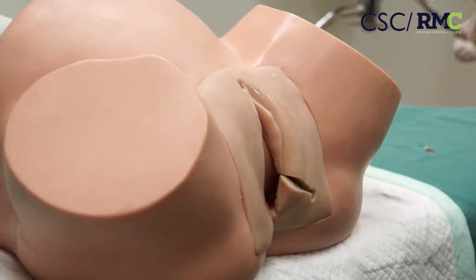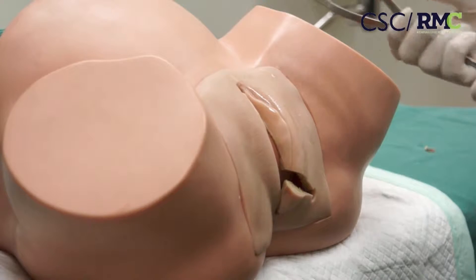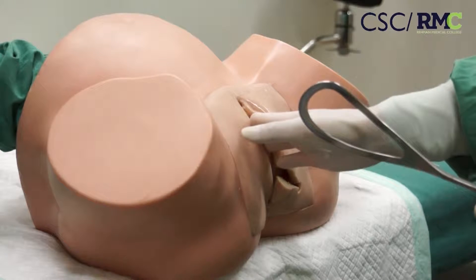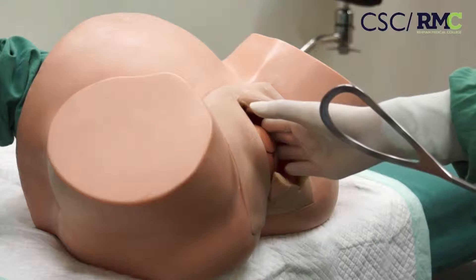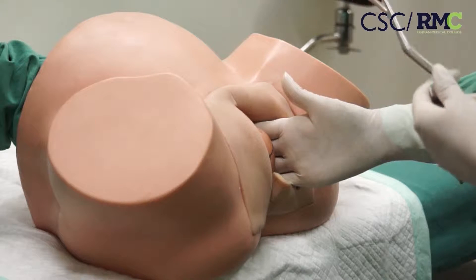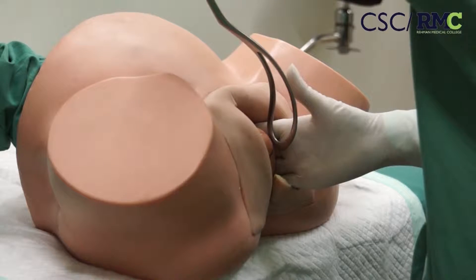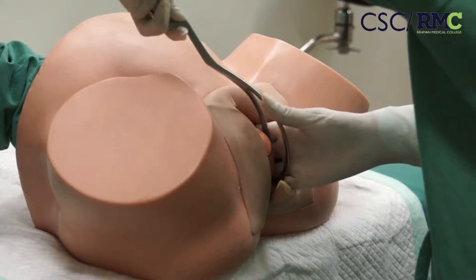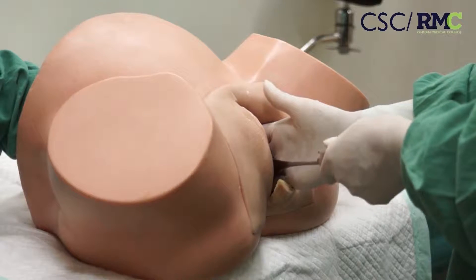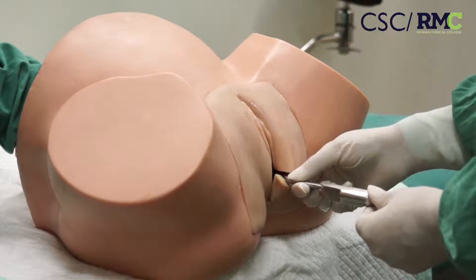First, the left blade of the mother is selected and lubricated with paraffin before application. The obstetrician's right hand is inserted between the left maternal vaginal wall and the fetal head to guide the forceps blade. It is inserted at 90 degrees and swept between the hand and fetal head. The blade must be positioned in the center of the pelvis. Ask your assistant to hold this blade in the center.